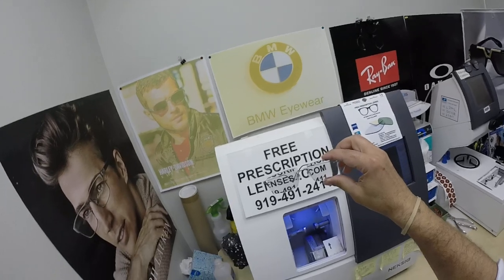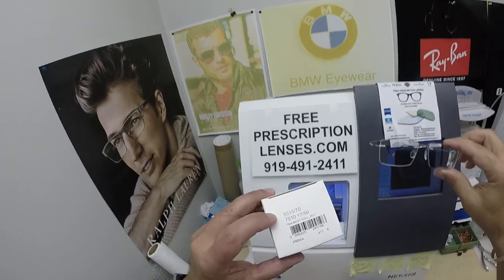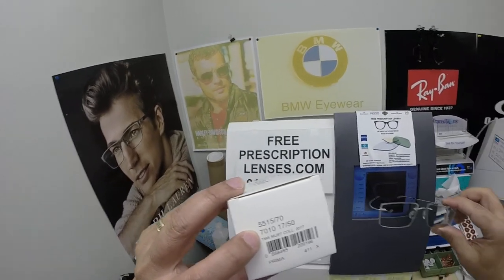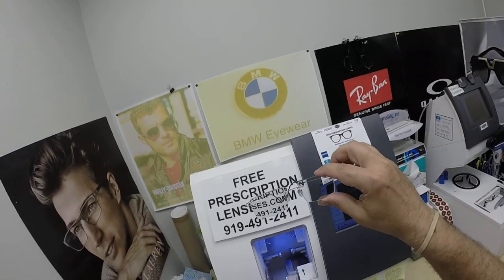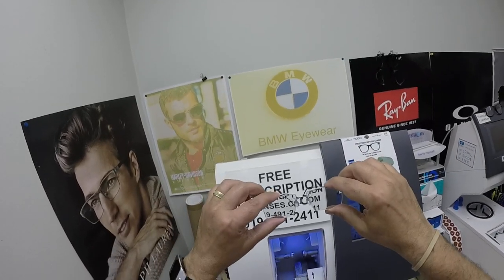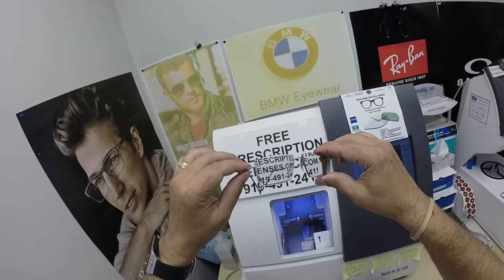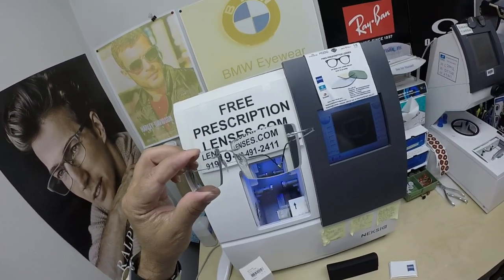Thank you so much for the purchase of the Silhouette model, chassis number 5515, color 7010, silver, 17 bridge, 150 temple length, shape CL in the 54 eye size. Hopefully now everyone else has gotten a chance to see how I bring that loving feeling back to glasses. Thank you.